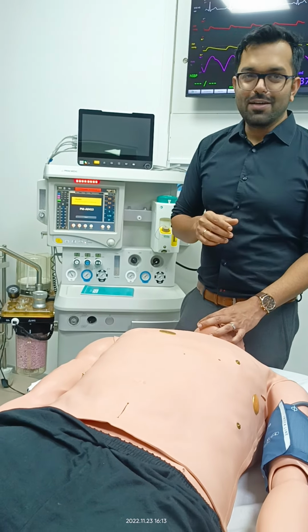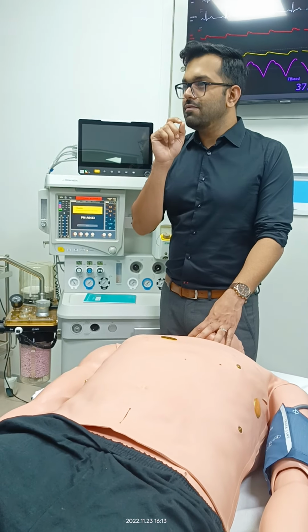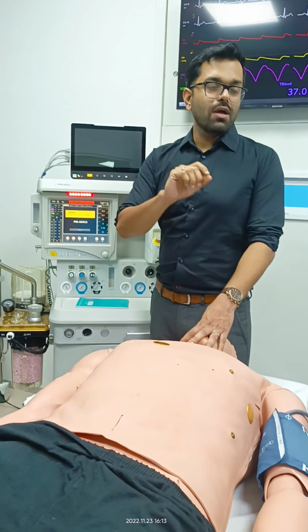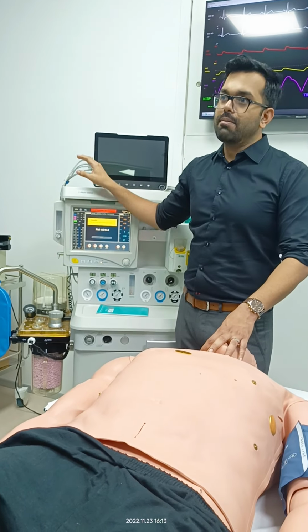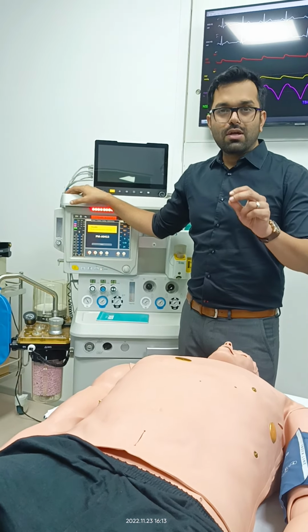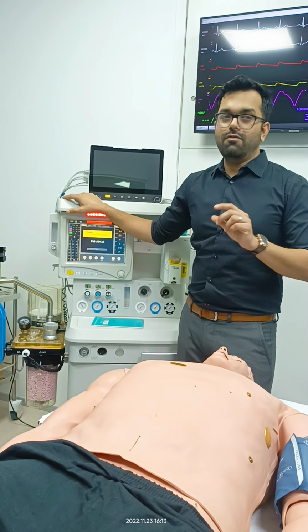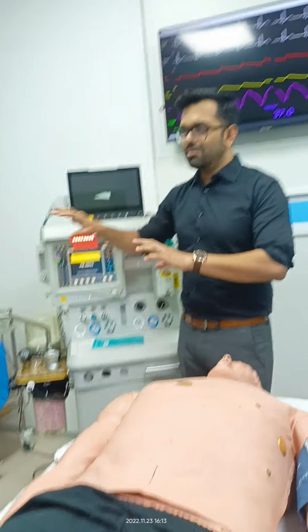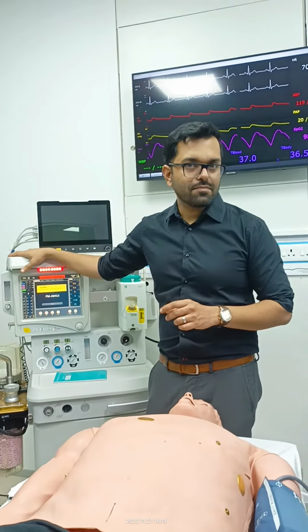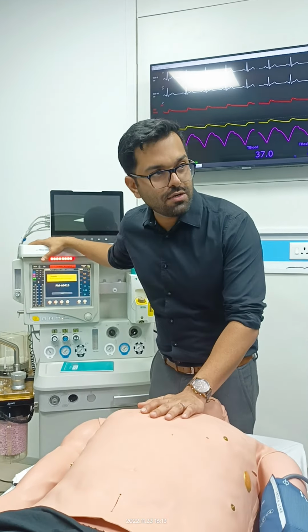Chest rise, come on. Capnography. Capnograph. It's a very good tool, the gold standard to confirm endotracheal position of the ET tube. If you have a capnograph, you can immediately tell whether you are in the esophagus or in the trachea. If you are in the trachea, you get the graph. If you are in the esophagus, however much you ventilate, it won't come. Once the capnograph comes, that means you are in the tracheobronchial tree.